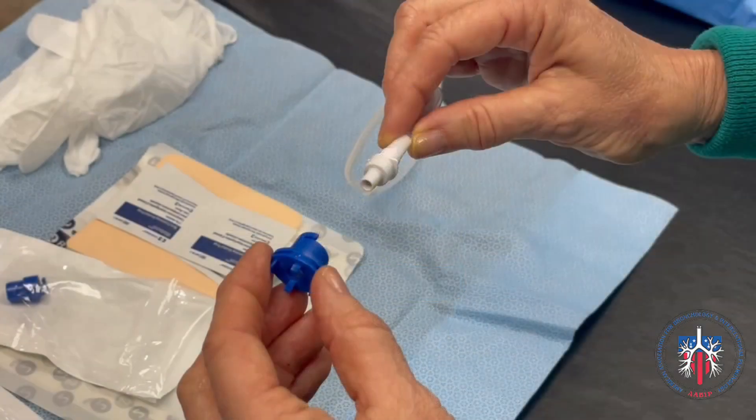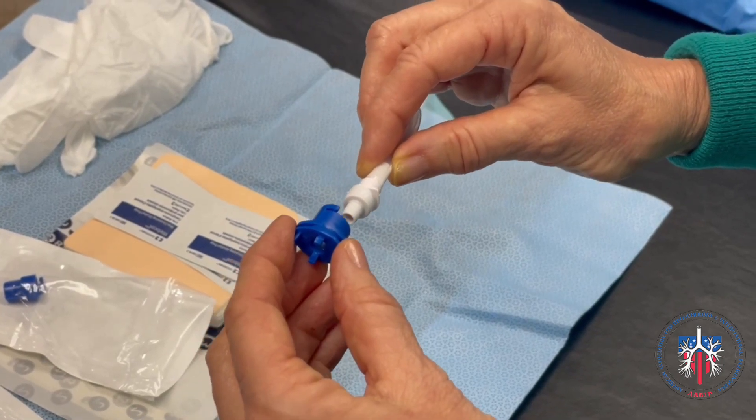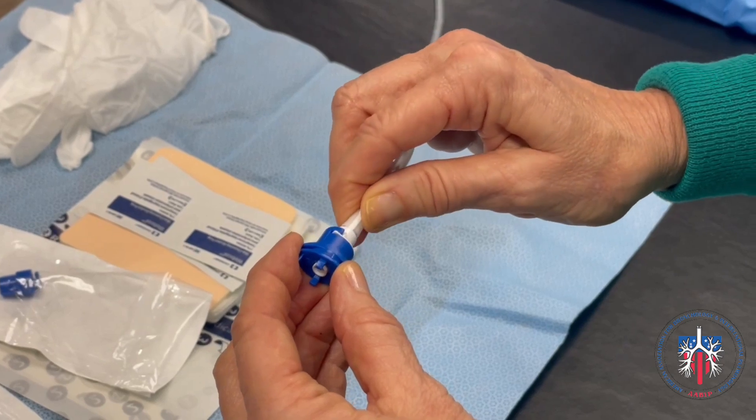Once the Plurorex valve cap is removed and the tip of the Plurorex Catheter is cleaned, the Plurorex adapter is inserted onto the Plurorex Catheter. It is locked into place with a twisting motion.